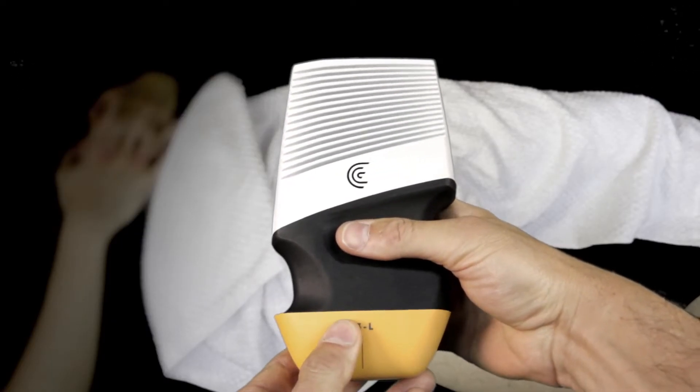My name is Jeff Sands. I'm an emergency physician from Kelowna, British Columbia. I'm going to be demonstrating how to perform the DVT scan using the Clarius scanner and the clip-on attachments.